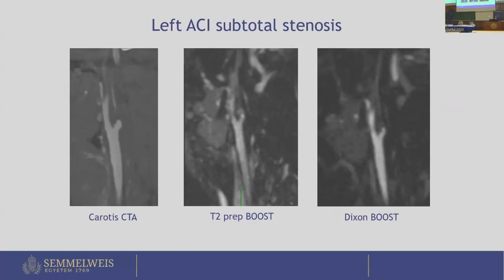So here you can see a good correlation compared to the CT angiography.